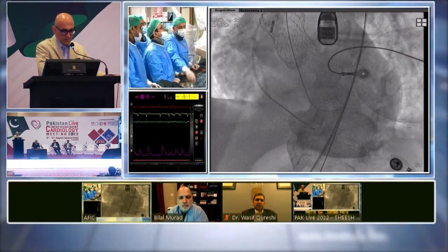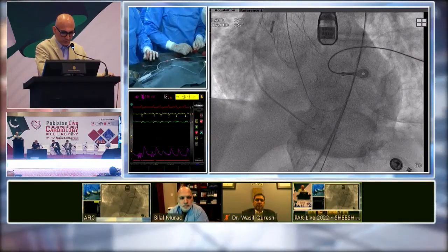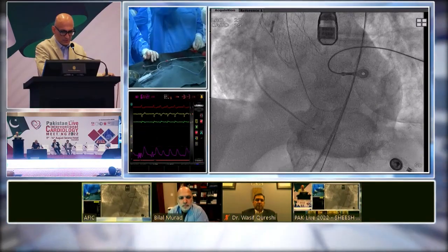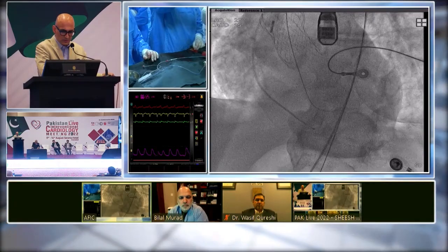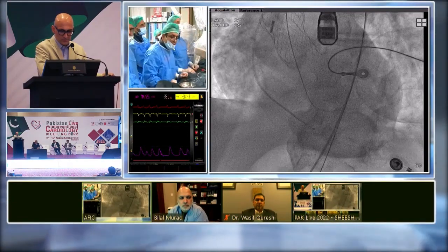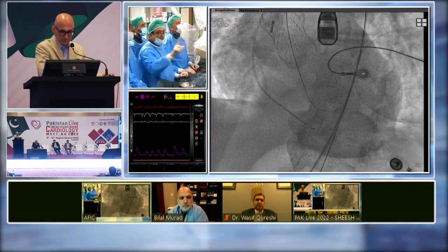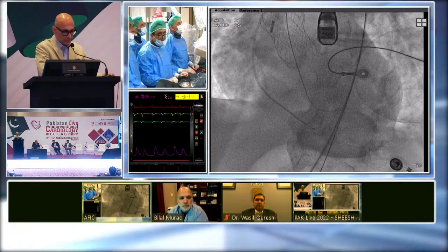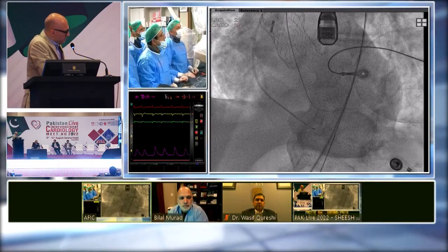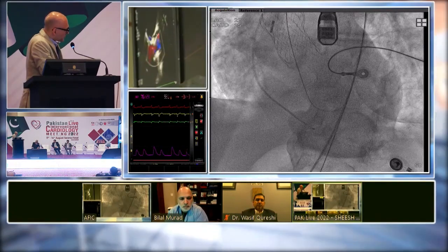So Omer and Asad, are you guys happy with the valve position? What are your thoughts? Where do you, Dr. Siddiqi, where do you usually like your valve? What's your depth goal for your cases?